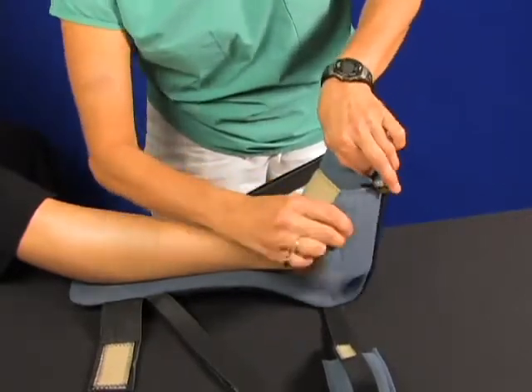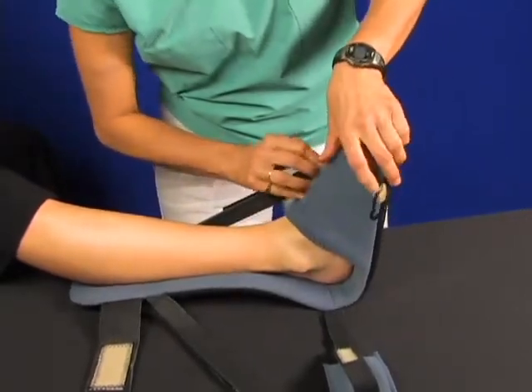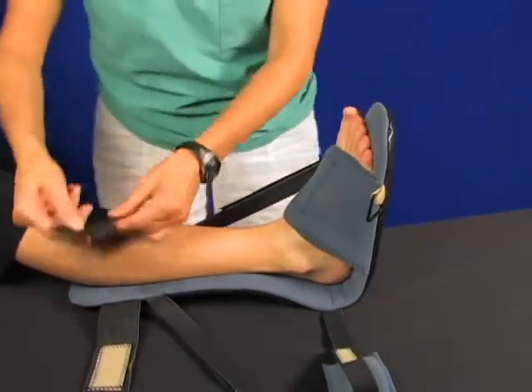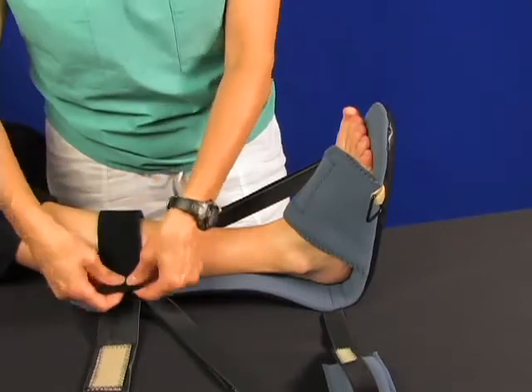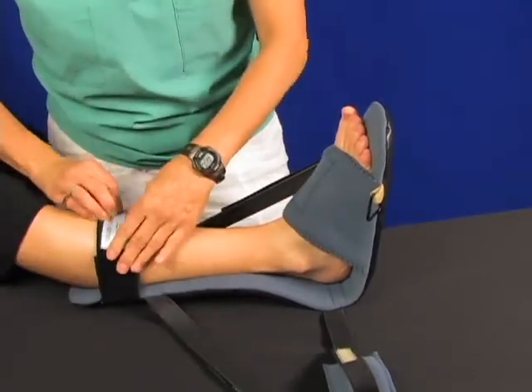First, you want to strap up the foot — get that nice and snug. Next, you want to strap up the calf strap. You can cut the strap if it's too long or just fold it back. Snug up the calf strap for a comfortable fit.